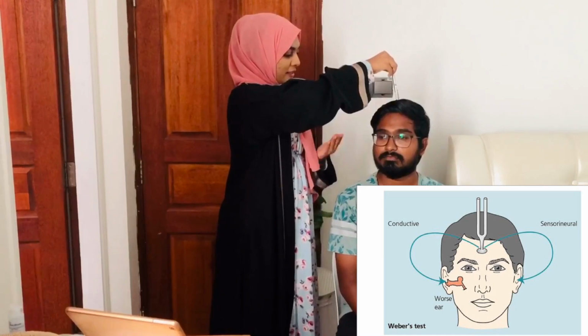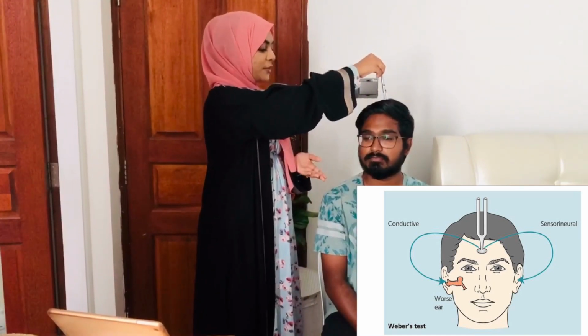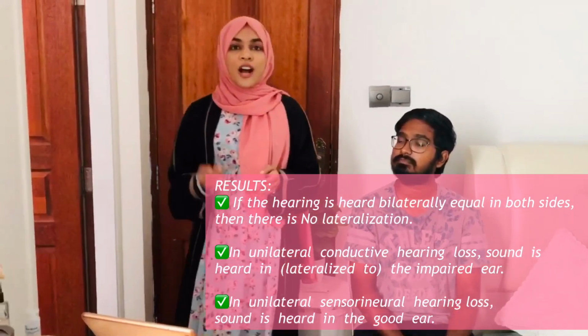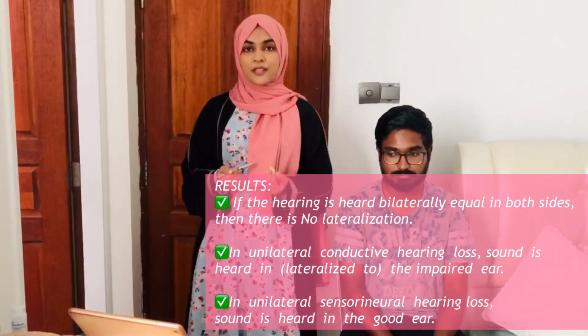So I will first put this into vibration. Can you hear the vibrations? Yes. From which side do you hear it more? Both sides equal. Thank you. So after the test is done, you will have to explain to the patient what you got.